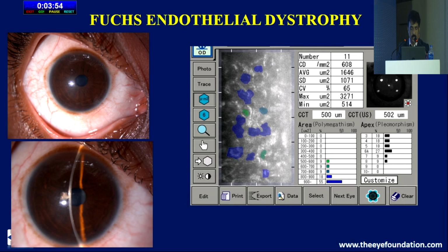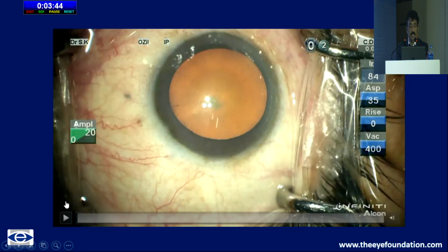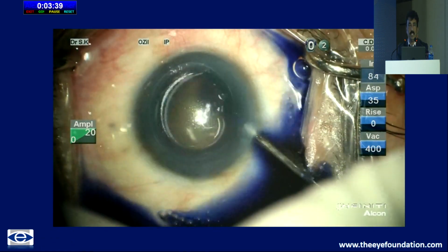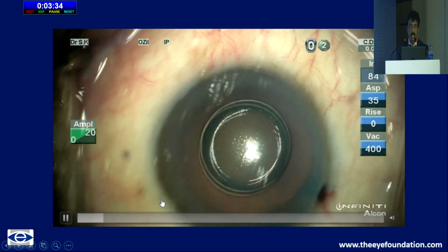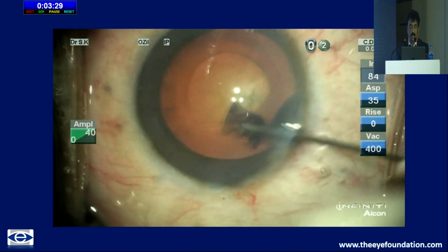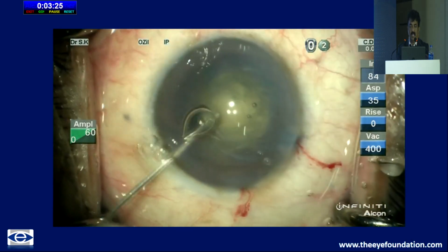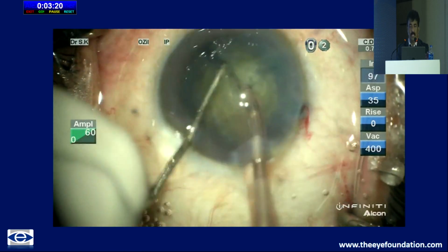So this is a case of stage 1. Actually, you can see there is some amount of edema. It's between stage 1 and stage 2. The patient is slightly symptomatic, and when you are doing phaco alone, you have to take certain measures. Ideally you should do a sclerocorneal tunnel, because the peripheral cornea is almost normal. You don't want to disturb the peripheral cornea, which is normal.